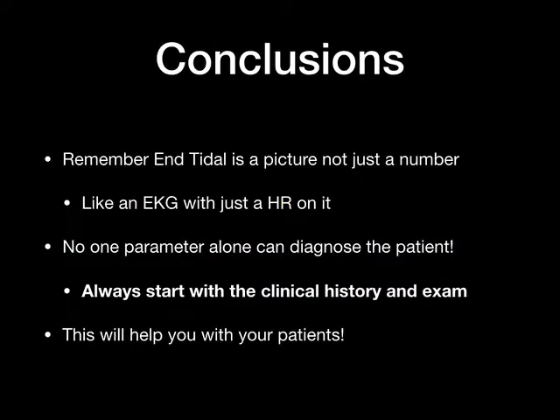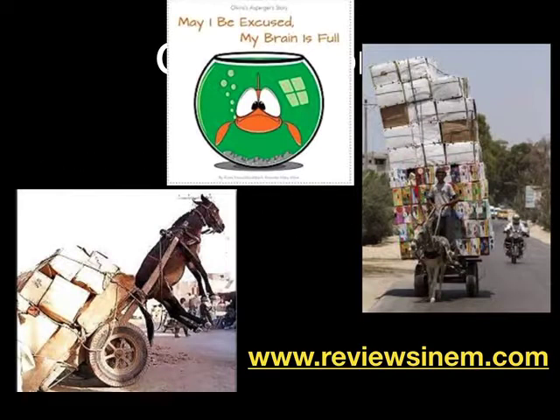So in conclusion, remember, end-tidal CO2 is a picture, not just a number. Just like you wouldn't want an EKG with just a heart rate on it. But no one parameter alone can diagnose our patients, so we always have to start with a clinical history and a good exam and see how that correlates. Because all this will help with your patients, and you'll be an end-tidal CO2 pro. Hopefully that was helpful and not too overloading for anyone.